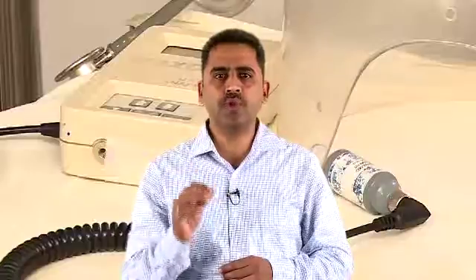Let us study what are the precautions while handling the oxygen analyzer. Do not pull or bend the sensor, as this is the most important and extremely fragile component of the equipment. One should always calibrate the equipment before each measurement. Do not leave the oxygen monitor stored with the power switch on.